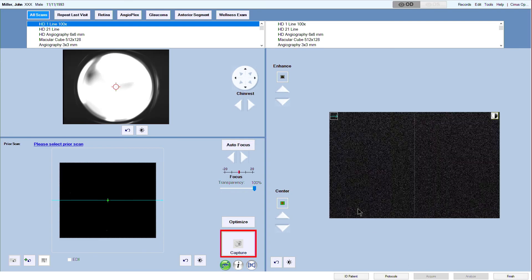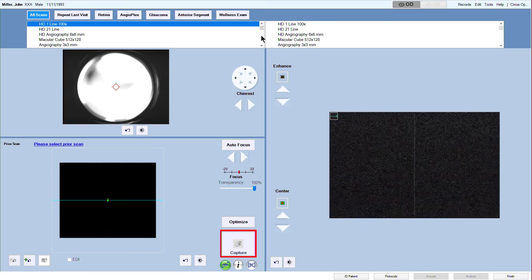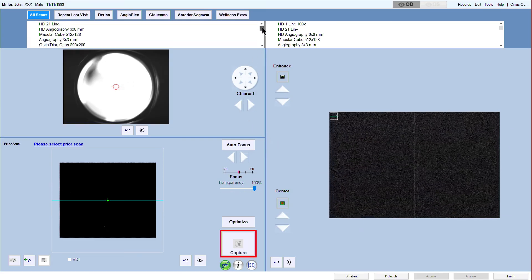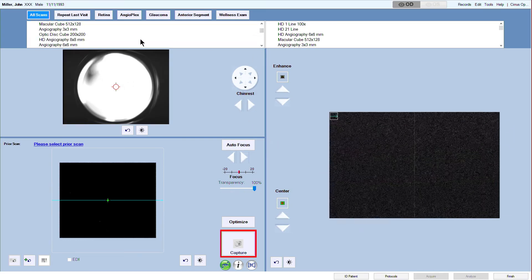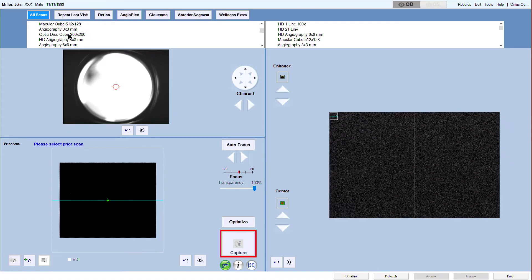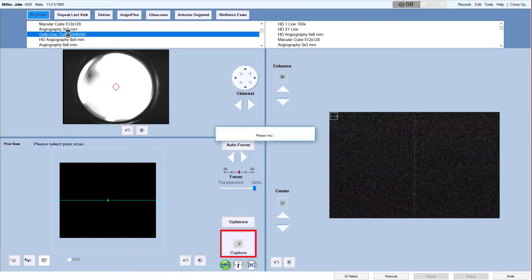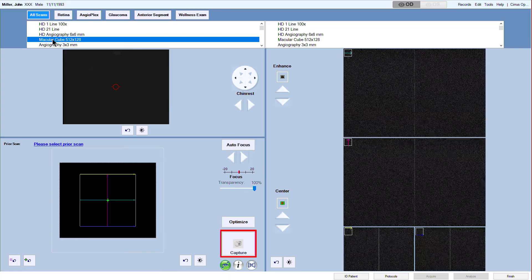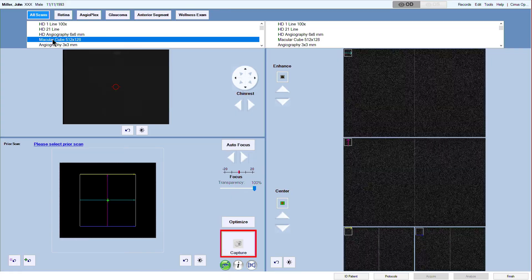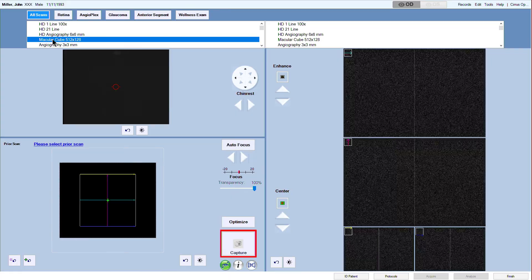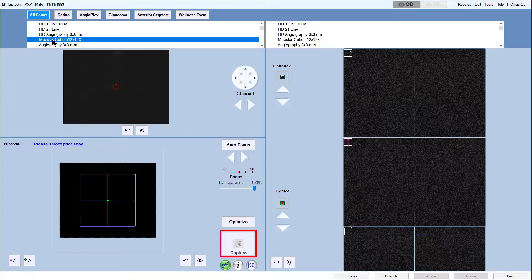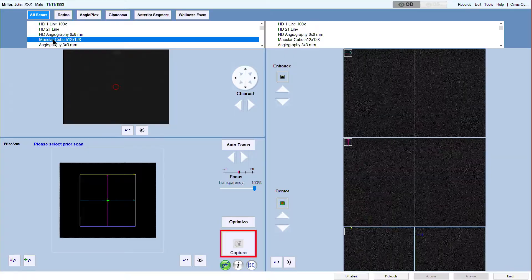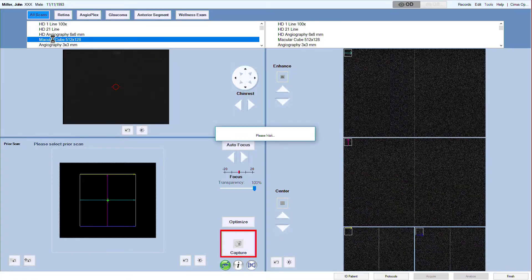Now you will see the Acquire screen. From the scan selector at the top under the appropriate eye, OD, select Optic Disc Cube 200x200. Once the scan has been selected, the automated chin rest will go to the default position for the selected scan type and eye.